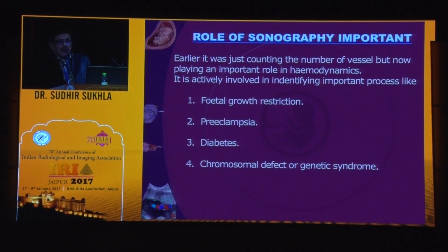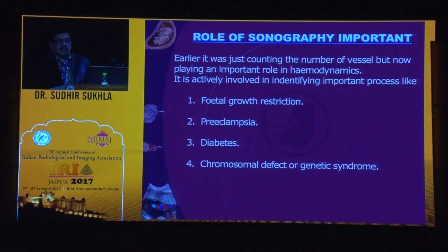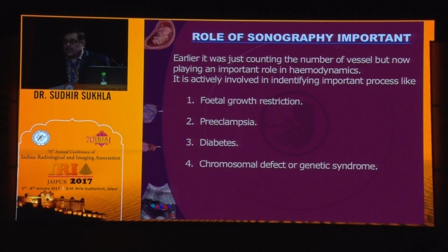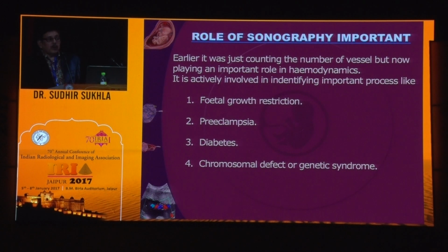The role of sonography is important. Earlier it was thought that you just count the number of vessels and everything is over. But now it is playing an important role in hemodynamics. It is actively involved in identifying important processes like fetal growth restriction, preeclampsia, diabetes, chromosomal defects and genetic syndromes.